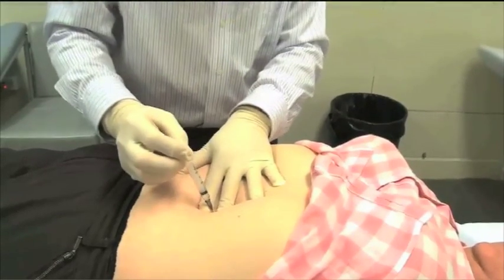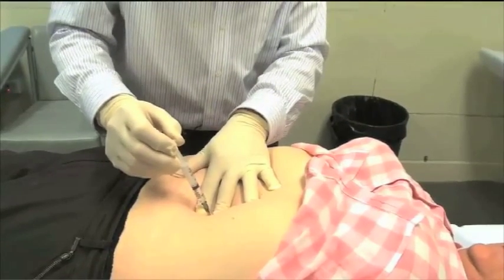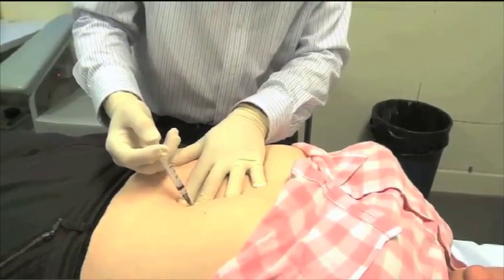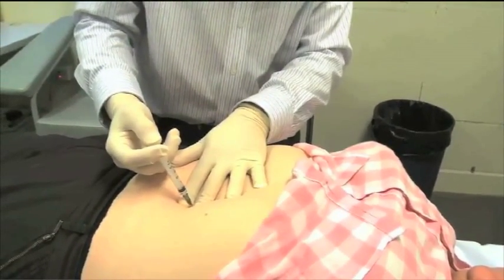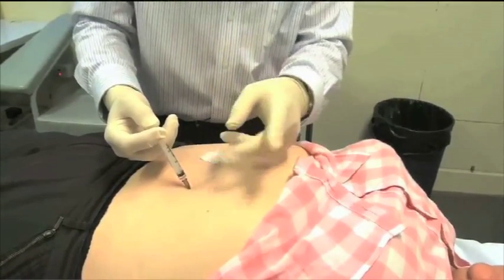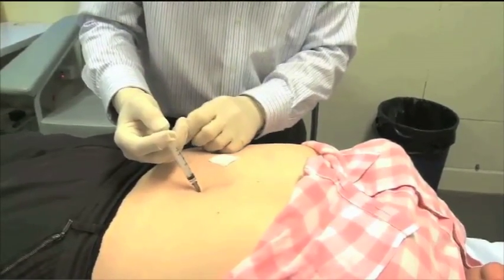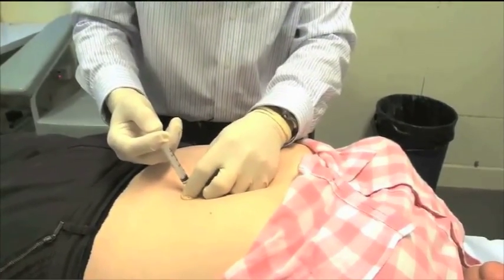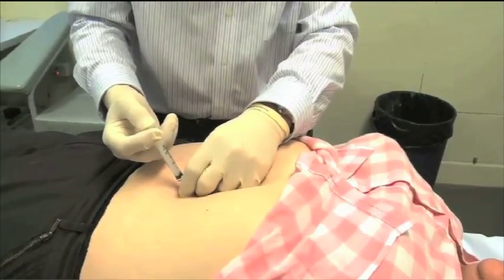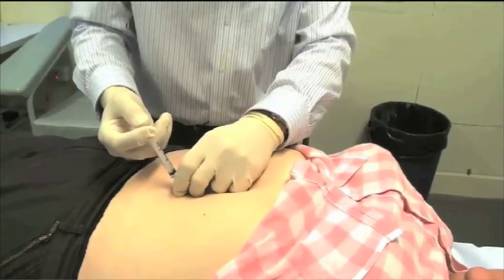...is on the back wall of the reservoir. We can easily take fluid out of the band to confirm that we're in the reservoir. And then I want to carefully add my 0.3 mls. Then when I add that fluid, I want to make sure that I keep the same amount there — I don't want to lose it. So your technique of removing the syringe is very important. We must control the plunger of the needle, we must control the bevel of the needle down here and push down as we gently bring it out. So we've added 0.3 mls — just gently bring it up, out of the silicone plug and out.